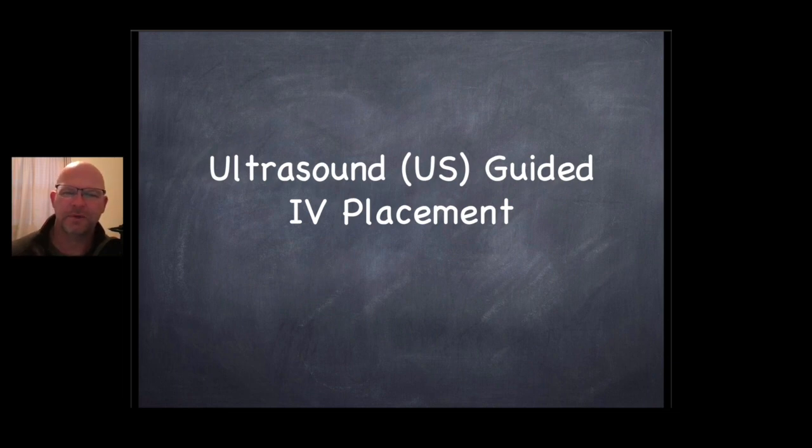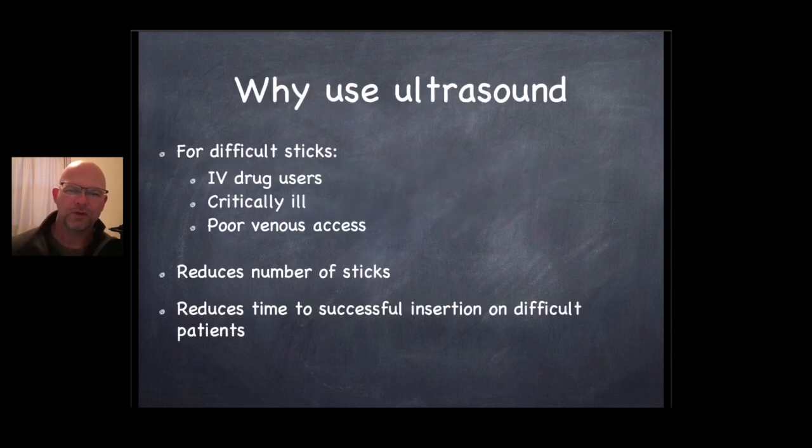My name's Scott. Today we're going to talk about using ultrasound to start IVs. So why use an ultrasound to start IVs? Well, for the ones who have large vessels that are easy to stick, it's a waste of time to use that, unless you needed to confirm the track of a certain vessel. We'll talk about that in a minute.